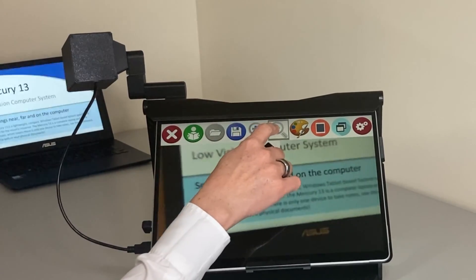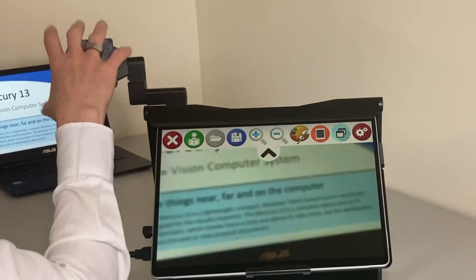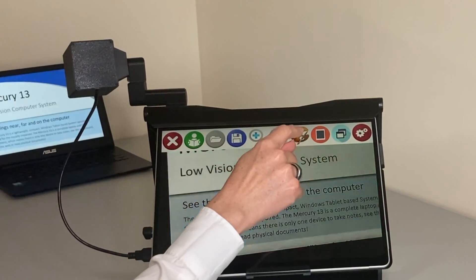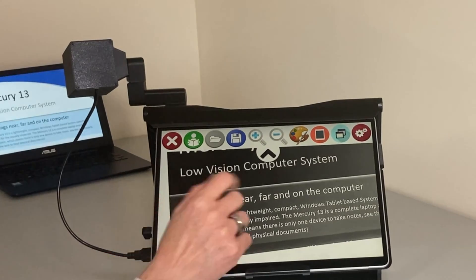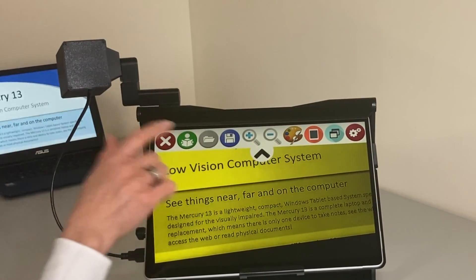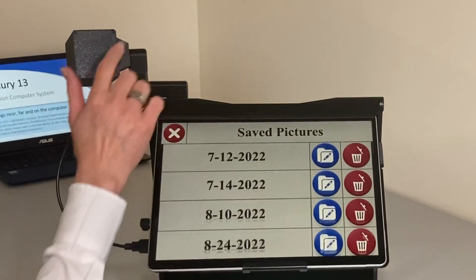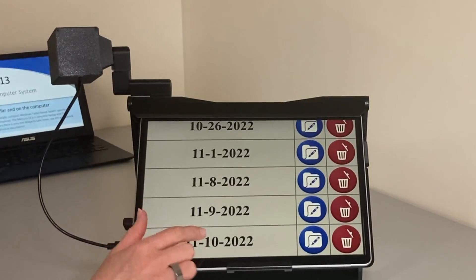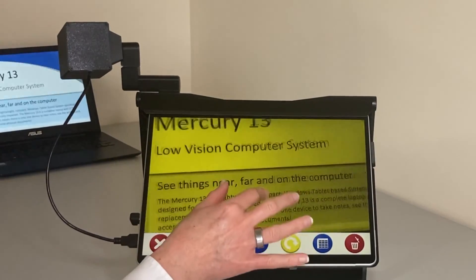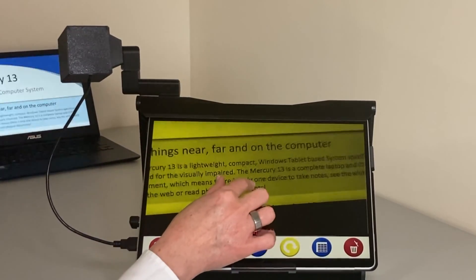I can zoom out a little to get the whole screen in, let it focus, and then apply color schemes just like with the near magnification. I can also take a picture and save a photo. Going into the dates — I have lots of photos — I can look at the pictures taken today, and there is the picture of the whiteboard with pretty much everything on it.